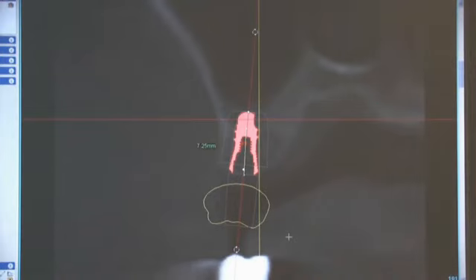And one of the advantages, too, for maybe more inexperienced doctors, is I would suggest a surgical guide, whether it's a directional guide to help you in the proper direction of the implant, or a true depth determining guide, which obviously can be done, as you just mentioned, Brad. It really allows us a lot of comfort, a lot of safety, and really puts the patients at a certain comfort zone, especially in a historically difficult situation, or a situation that we were more concerned with.